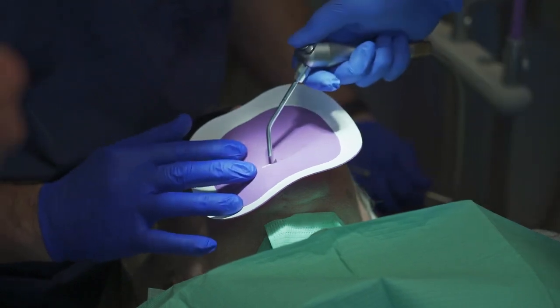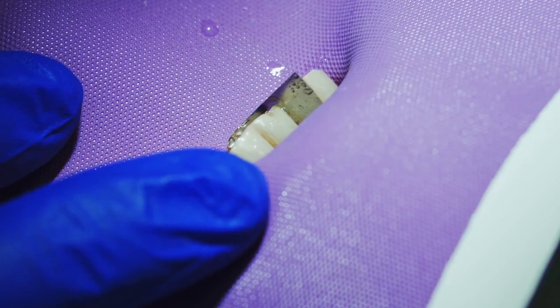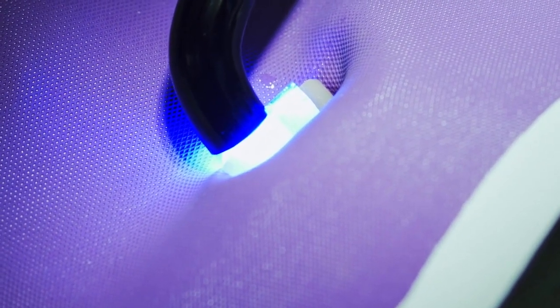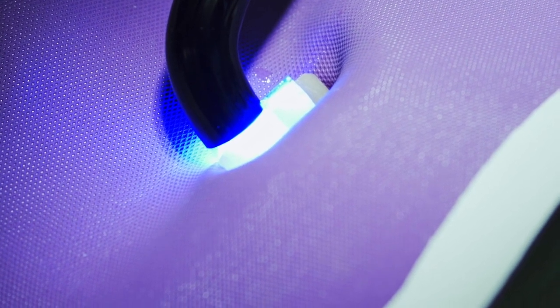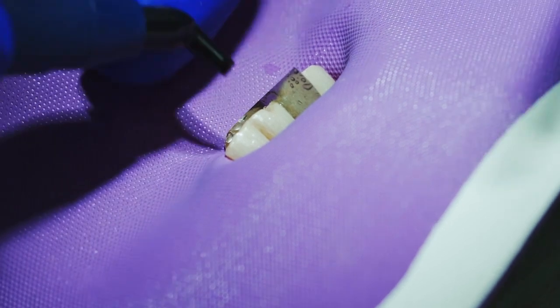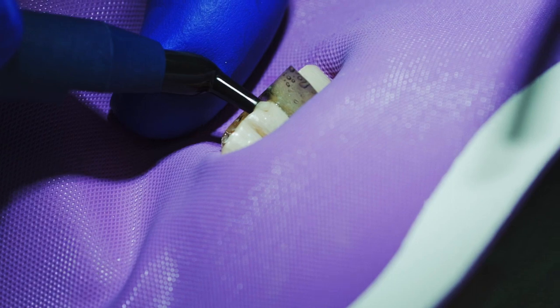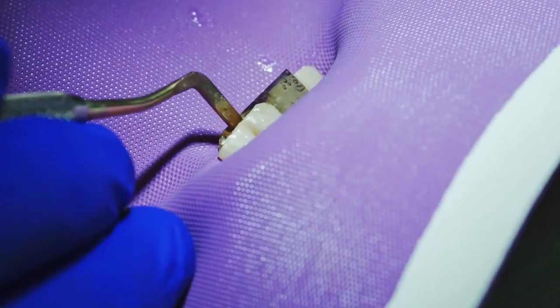Now we'll proceed with whatever composite resin you're using in your office. This product is exceptionally good for anteriors because it changes the adhesive stress from a shear to more of a compressional strength, and it allows the filling to stay in place. I've also placed these in the posterior — it works in any part of the mouth.